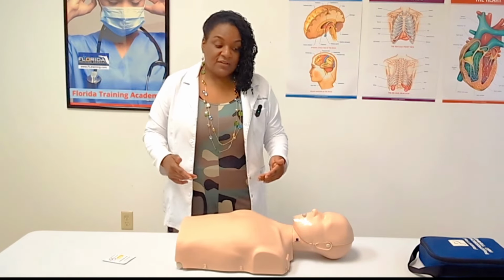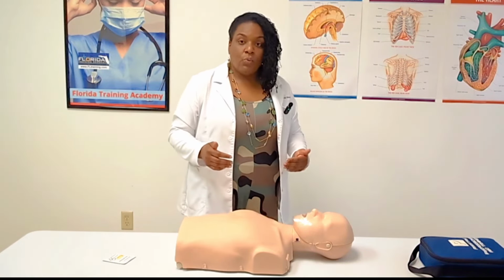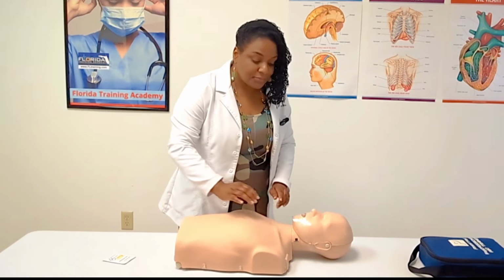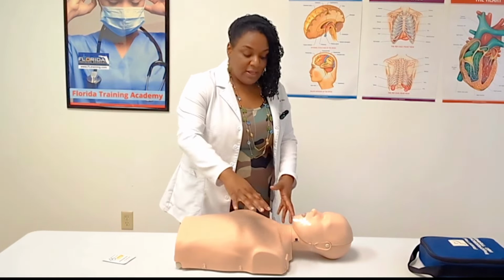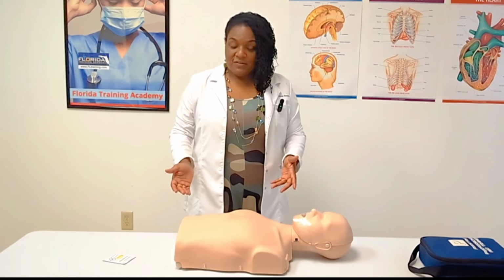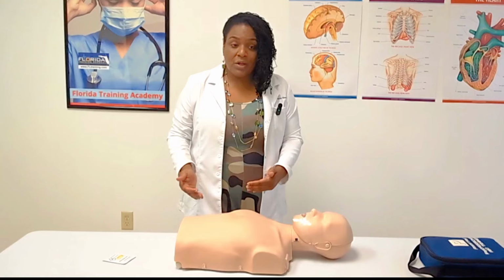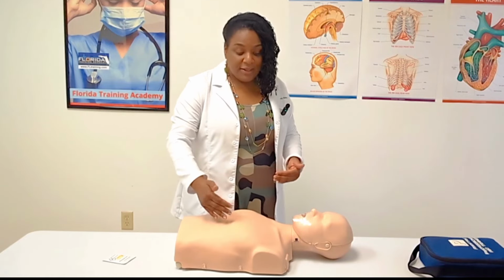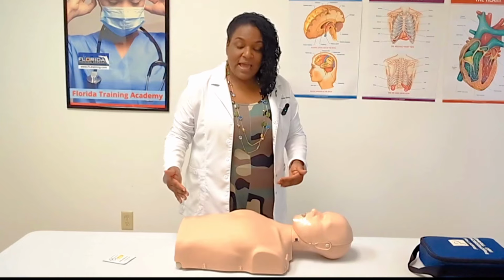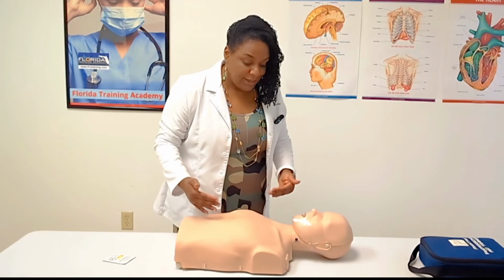Once you establish that the scene is safe, you're going to try to wake the victim up. Hey, are you okay? Are you okay? Be careful. I recommend tapping on both shoulders, not just one, because if this person had a history of a stroke where one part of their body was weak, if I'm only tapping on one shoulder, they may not feel me tapping. So I'm really trying to stimulate them.